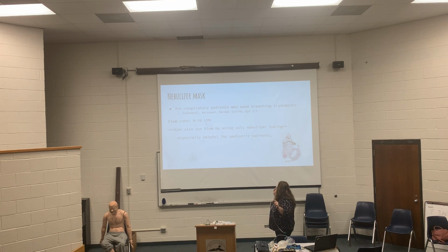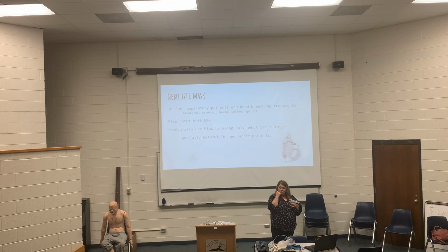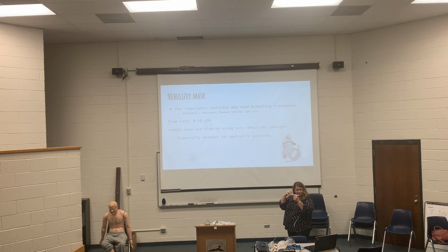But, so, something to keep with, and I put down here, this is especially helpful for pediatric patients. Babies are not gonna tolerate something on their face like that, unless they have asthma and they're used to it, then the kids don't really mind that much. We actually used to have a telephone one that looked like a little telephone that they could hold by their mouth, and it would go, and I wish we still had those, but we don't. You can either have mom, which will probably be the most effective, or you put it by their face, so when you are aerosoling it, you can close this end with this hand.